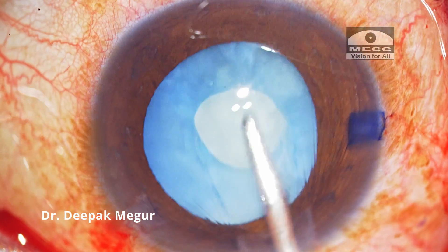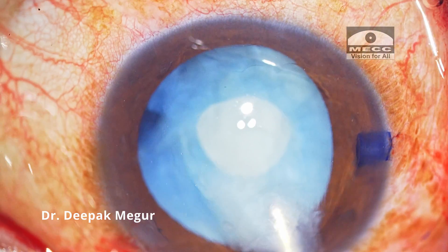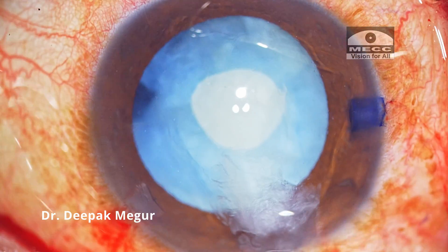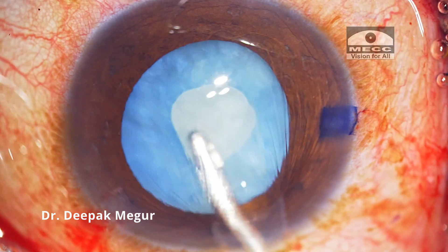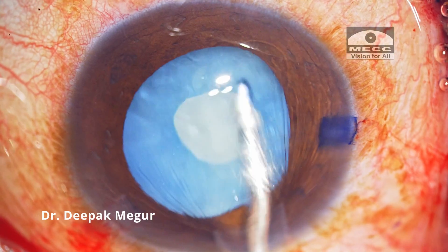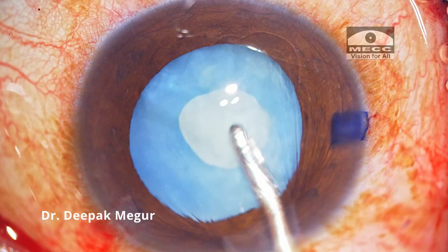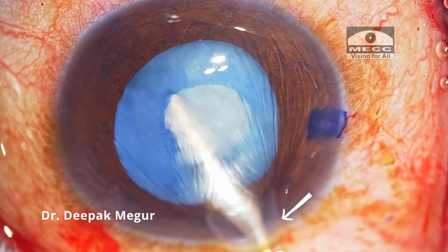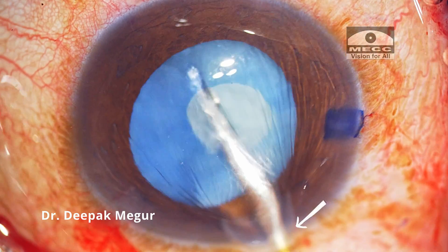To achieve this, I'm using a passive irrigation technique wherein I'm just using an irrigation cannula and tapping and nudging the nucleus on its edges so that the trapped cortex behind the nucleus is passively brought anteriorly and then flushed away. There is one critical step while performing this technique: I always need to compress the floor of the main incision so that a sudden rise in the pressure inside the chamber and in the bag is prevented.